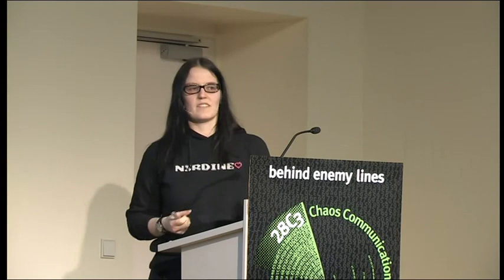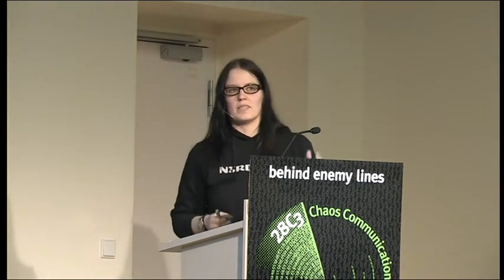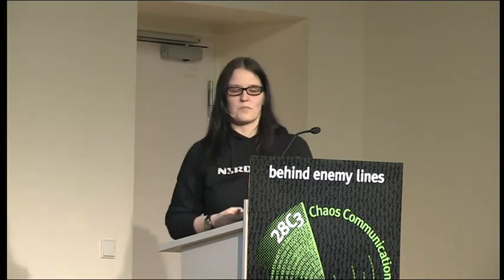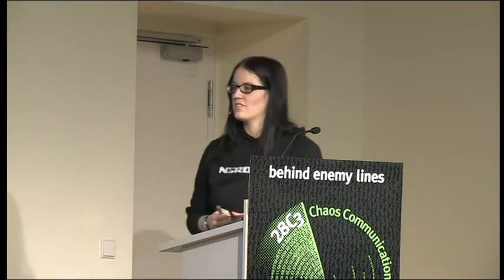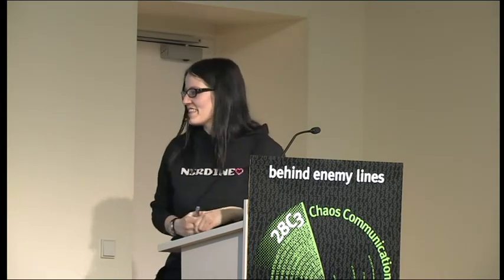So all the information is actually there, but I don't see any of the hearing aid vendors adapting to that. And I also think, there are people building 3D models of houses, and you could take this information into consideration as well. If I have never been to the BCC, but someone has made a 3D model, you could calculate the acoustic characteristics of the room. And then, before you go to the Congress, you could download the acoustic settings for your hearing aids. That would be really cool. But, well, this is just ideas.